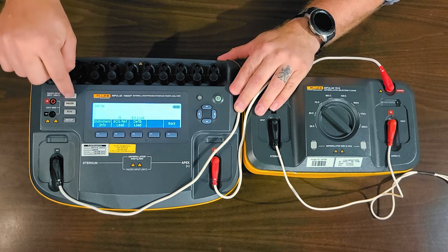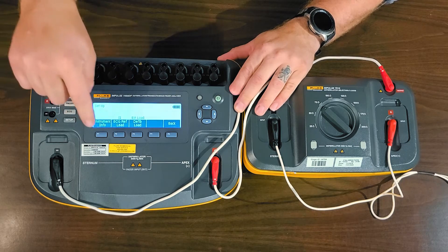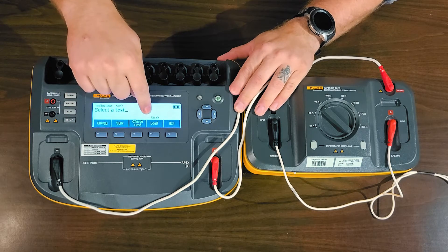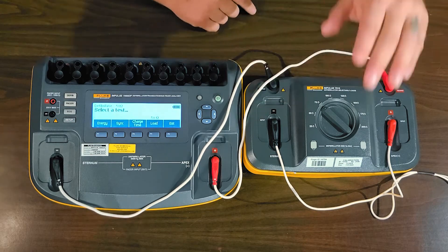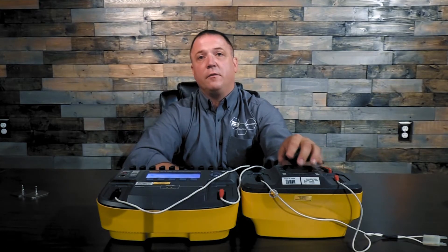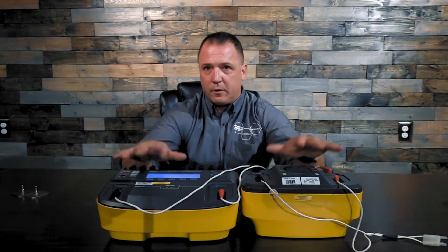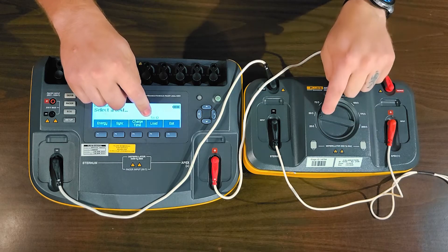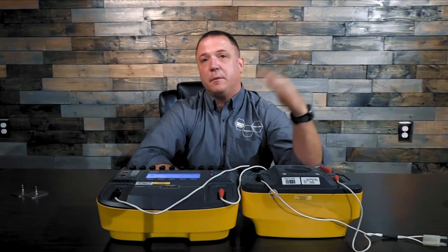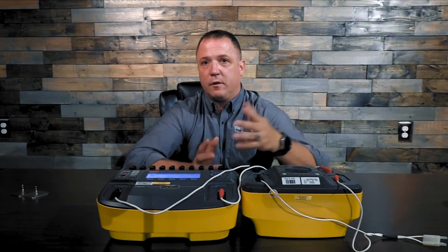Once we do that, we're good to go to the Defib screen, and you'll see above load it says 50 Ohms. On the 7010, I'd have to set it to the corresponding 50 Ohms as well. Most service manuals have you start off testing at the 50 Ohm load. Once both devices say 50 Ohms, I do my energy output test and start doing the joule discharges at what the service manual recommends.